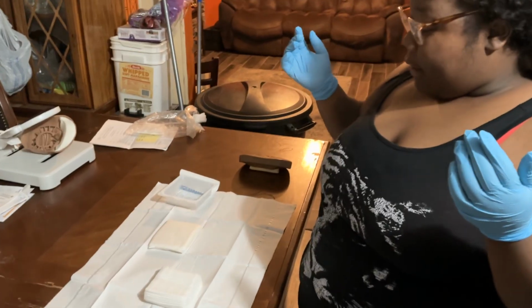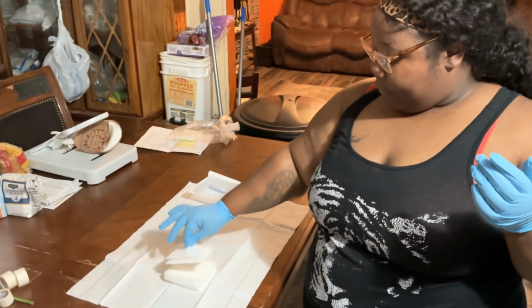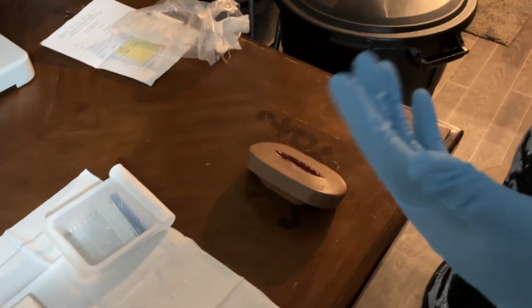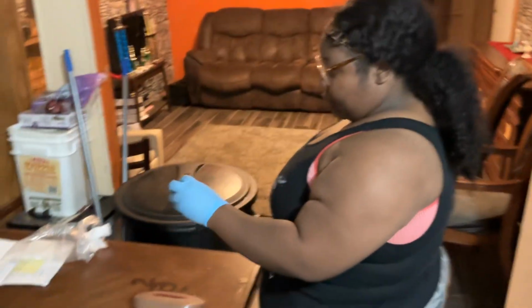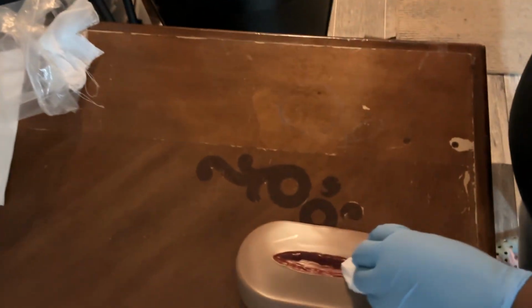So what I'm going to do now is reach down, get me a sponge, soak it, take it out, put it in this hand. Okay, I didn't reach over my Sterifill. I'm going to go right down the middle of my incision and clean it out.